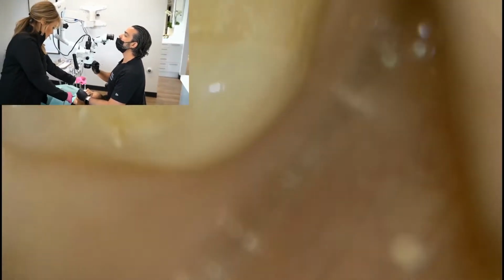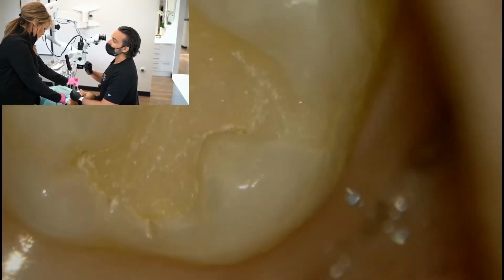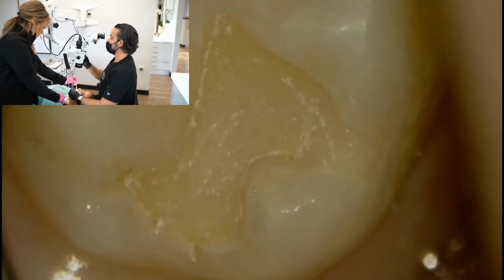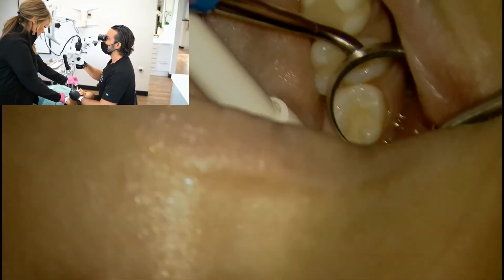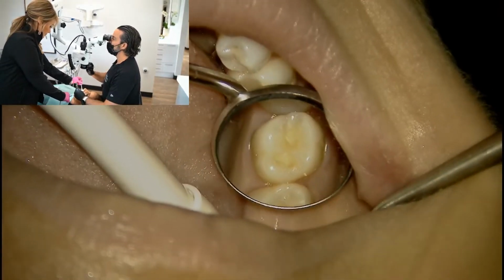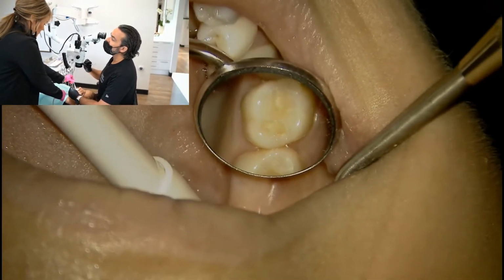All right. Okay. Kind of fun. Looking at things, let's see.